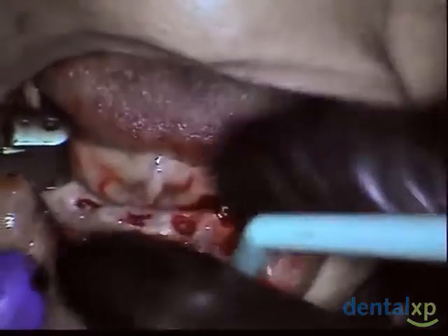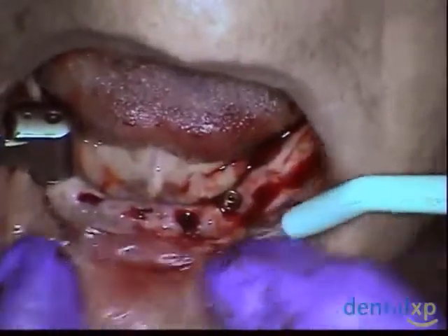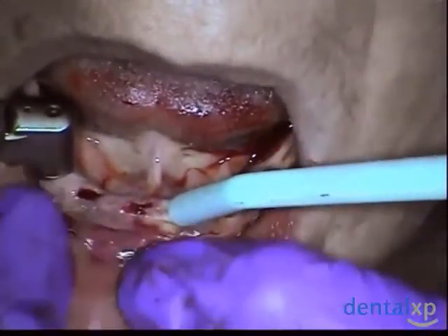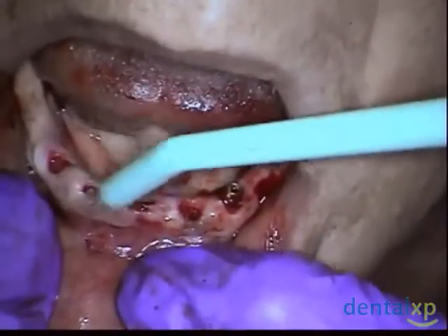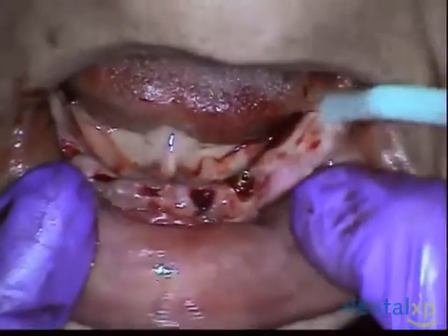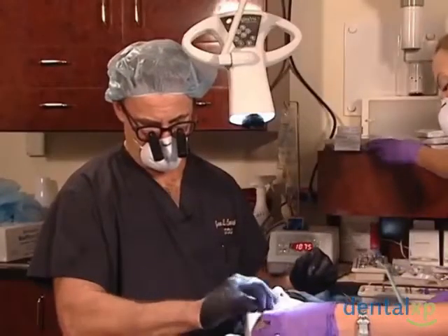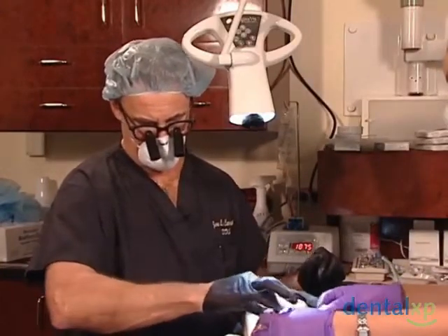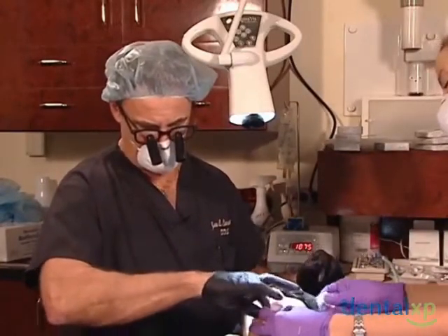And here, I'm not to the cortical plate there. I'm slightly superior to it. So I'm not going to turn the motor on at 325 to create any more depth because I don't need to. For those that haven't done many implants, and excuse me if those that are looking at this say, I knew that.